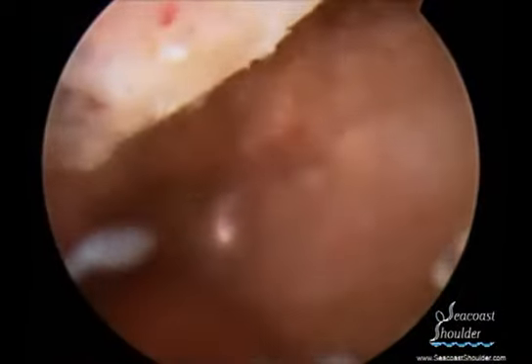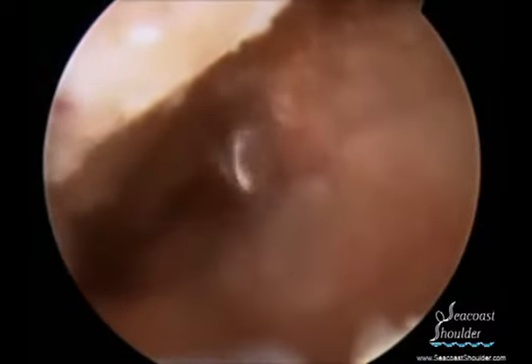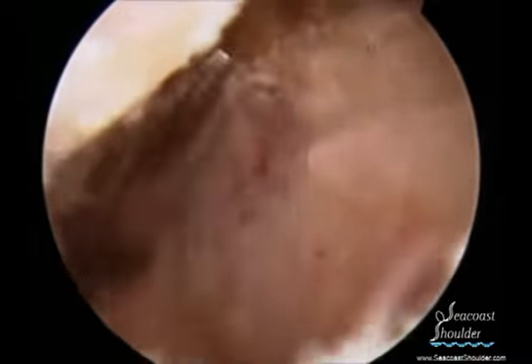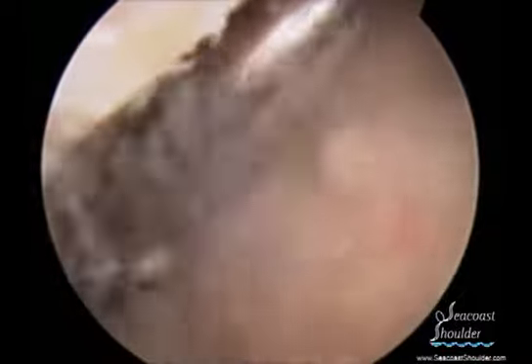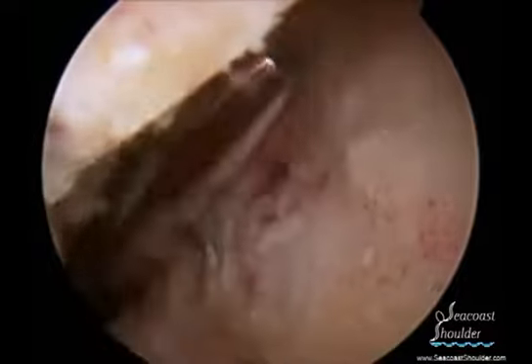In this video, the burr continues to work in a slow, methodical fashion, removing the end of the clavicle. It is important that the resection be even and that no bony prominences or bone spurs be left behind.